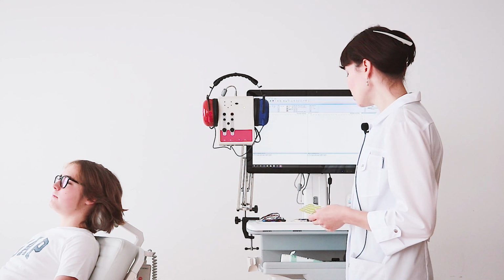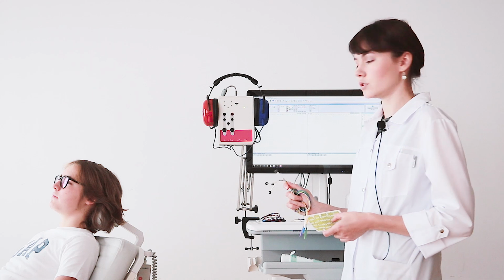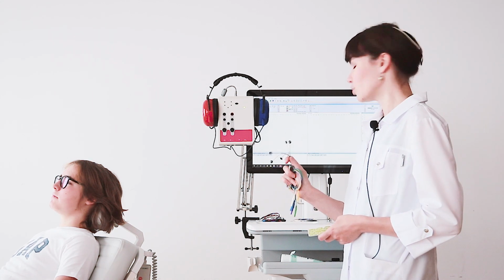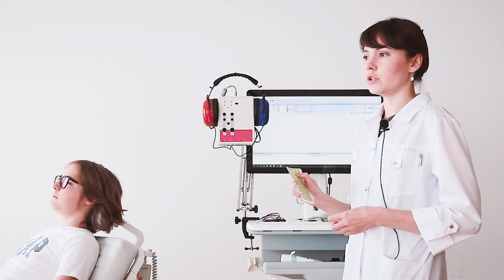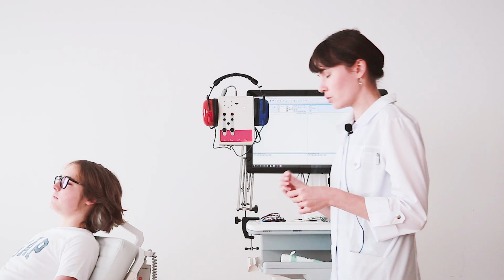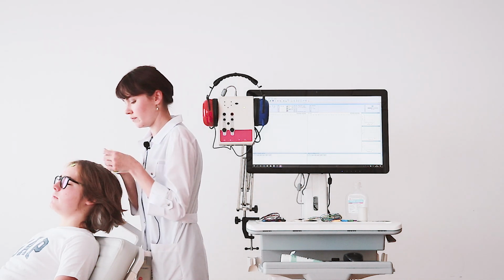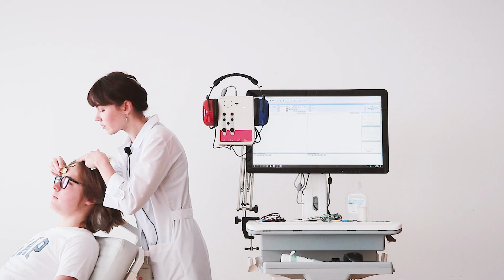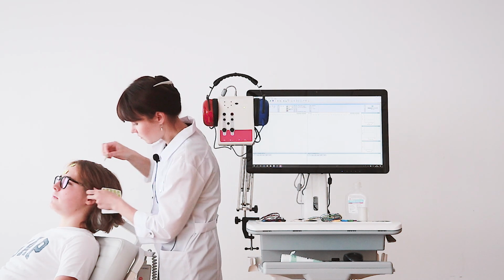Today we will use hydrogel single-use self-adhesive electrodes, but you can also use standard silver chloride or gold cup electrodes. Before applying this type of electrode, you need to fill the cup with the special conductive and adhesive paste. This type of electrode we will not prepare before applying. So we put the electrodes on the forehead and behind the mastoids.